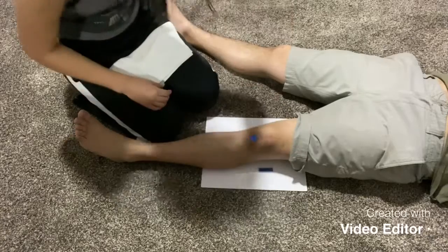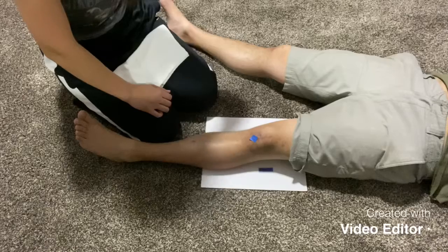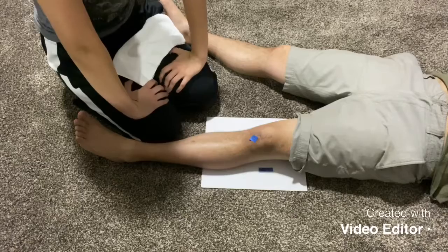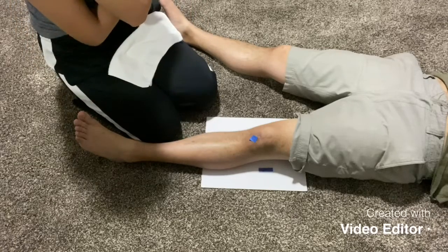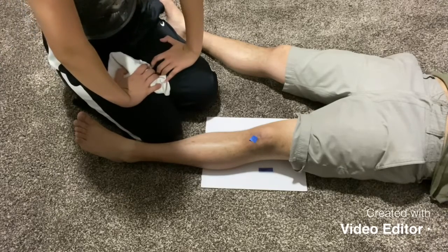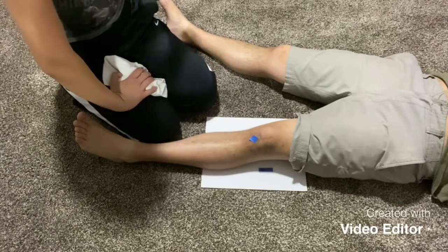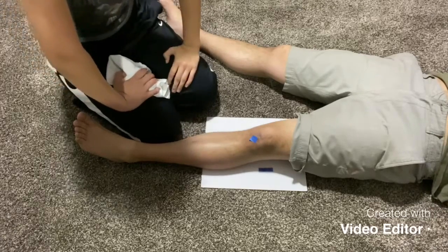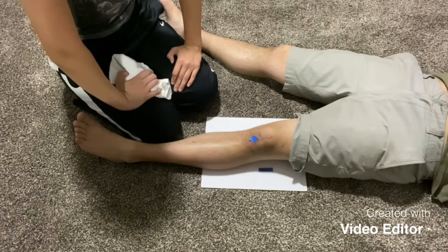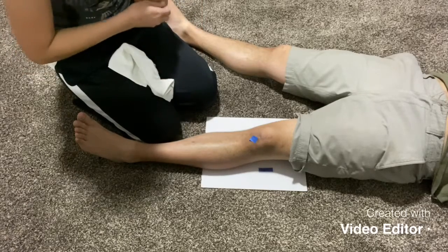This one I'm going to have a degree of angulation on my tube. That degree of angulation is dependent though. If the pelvis on the patient is less than 19 centimeters tall, then I'm going to have a 3 to 5 degree angulation caudad. If their pelvis is 19 to 24 centimeters tall, in that range, then there's going to be 0 degree angulation, and if it's larger than 24 centimeters, then I'm going to have a 3 to 5 degree angulation on my tube cephalad.